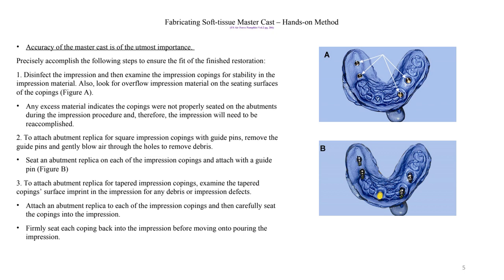If we believe the impression material was too much around the implant and may have pushed the impression coppings out of position, we can call the doctor and ask them to retake the impression. Once we examine the impression and confirm it is good and the impression coppings are stable, we are ready to attach the replicas. The purpose of the replicas is to indicate in our master cast where the implants are — the location, position, and angulation — exactly as they are in the patient's mouth.